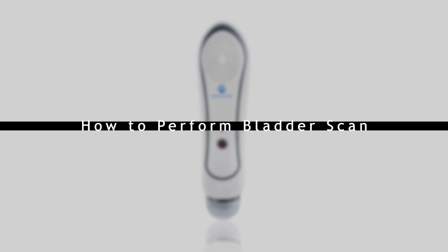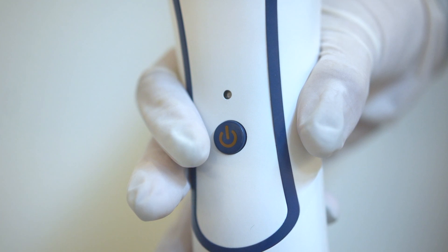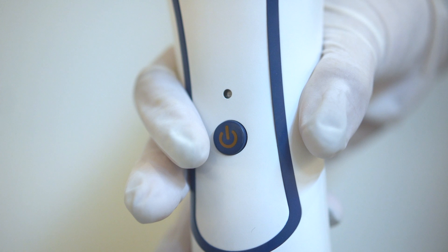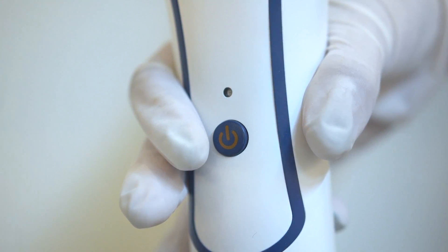After you get familiar with the device, we will show you how to perform a bladder scan. We recommend to hold the probe as shown in the video. Fix the probe by the thumb and the index finger and press the power and scan button using the index finger.